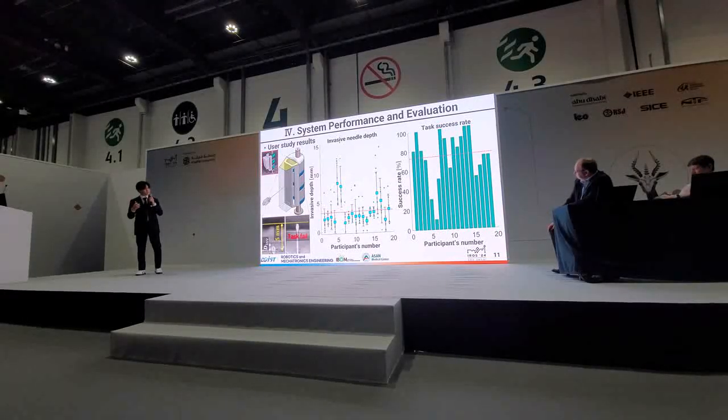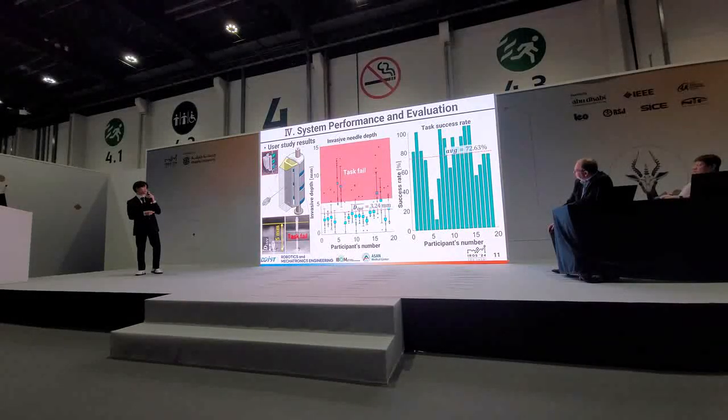Despite the participation of interventionalists with a wide range of clinical experience, the user study demonstrated that the mean invasive depth of the needle is 3.24 millimeters, and the success rate is 72.63% using the proposed system. Through the user study, we successfully presented the quantitative performance of the system.